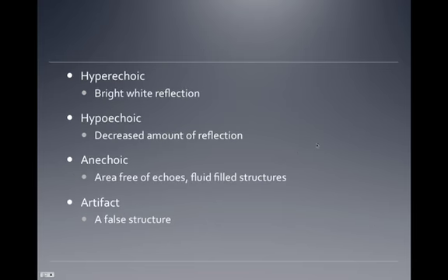All right, so you'll hear me use the term hyperechoic, and that's when we're seeing a very bright white reflection, or hypoechoic.